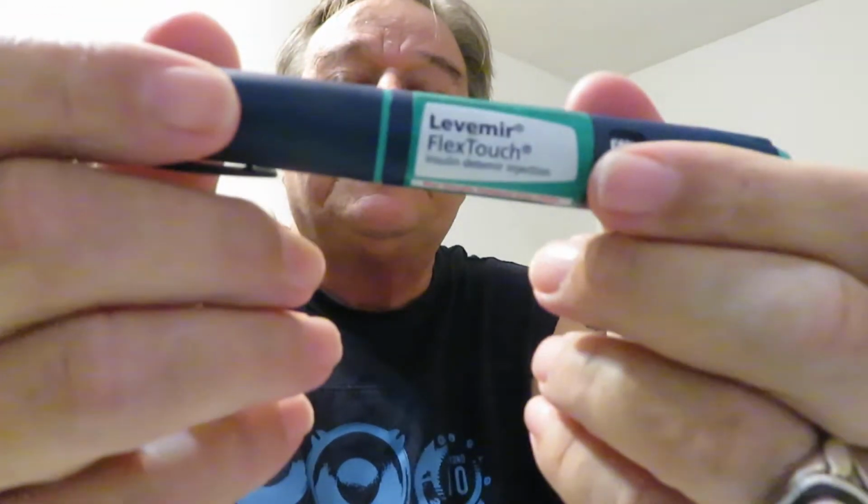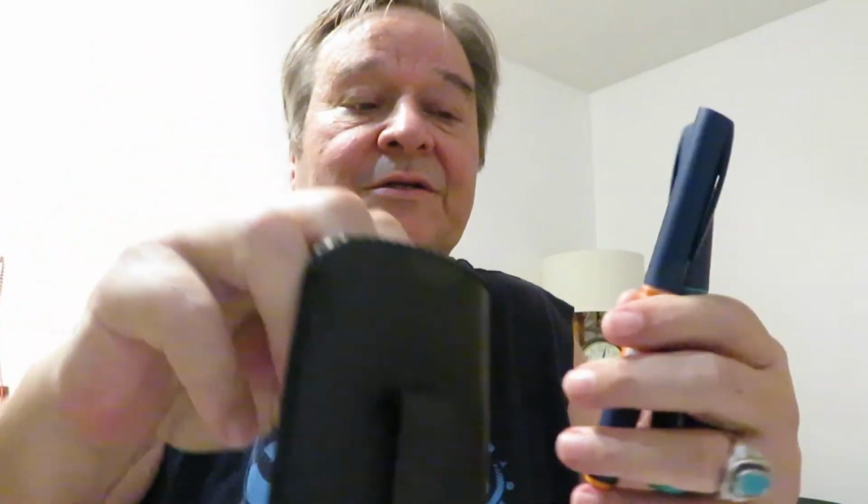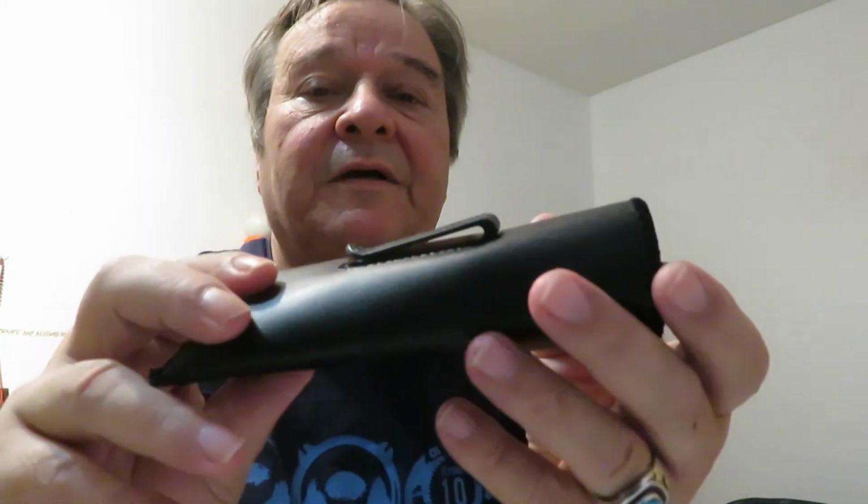Later on, I'm going to take 22 of the long lasting at 7. So this will be ready. The wife's wanting to go somewhere, so I'll get another needle. Take it off. Screw it on. It's not going to hurt. Then you got needles ready when you go somewhere. So there they are, like 2 pins in the pocket, and then my little invention that I showed before, the glasses holder. Even if you don't have the glasses holder, you got the pin clips. Just make sure you put the needles on there and bring a couple of the swabs with you, which you can put in your front pocket. You just have to wear a shirt or t-shirt with a front pocket. Then you're ready to go.